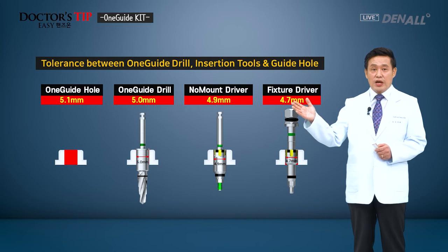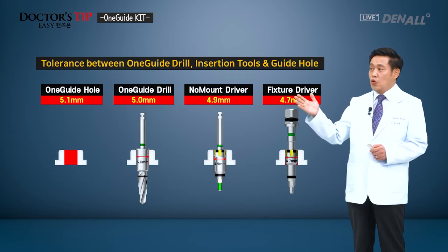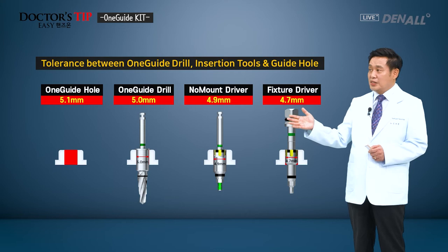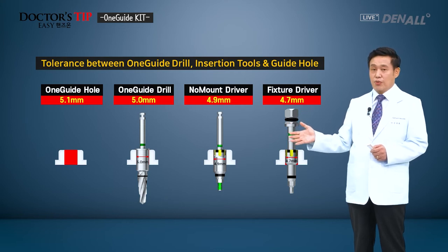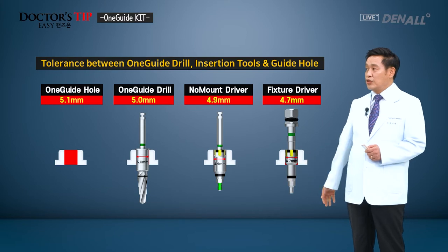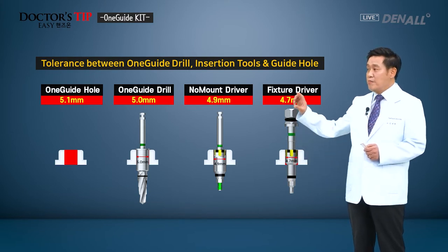Take a 5.1 millimeter diameter OneGuide hole, for instance. The OneGuide drill is 0.1 smaller, so 5.0 millimeter barrel. The no mount driver is 0.1 smaller from that, so 4.9 millimeter diameter. And finally, the hand wrench fixture driver is smaller, 4.7 millimeter diameter, and the barrel size is reduced there.